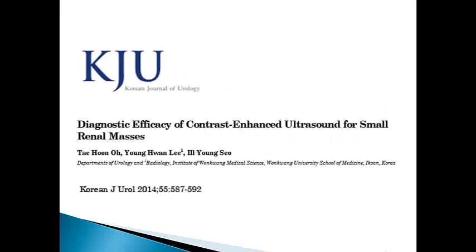One of the last things I want to talk about is a study which looks at one of the issues I've brought up during the course of this presentation, which is differentiating between small renal cell carcinoma and AMLs. This is a concern because small renal cell carcinoma can be hypoechoic or can be hyperechoic, whereas AMLs are generally hyperechoic. So they're very difficult to differentiate. One is completely benign, and one is malignant, and obviously you'd want to treat the patient accordingly.